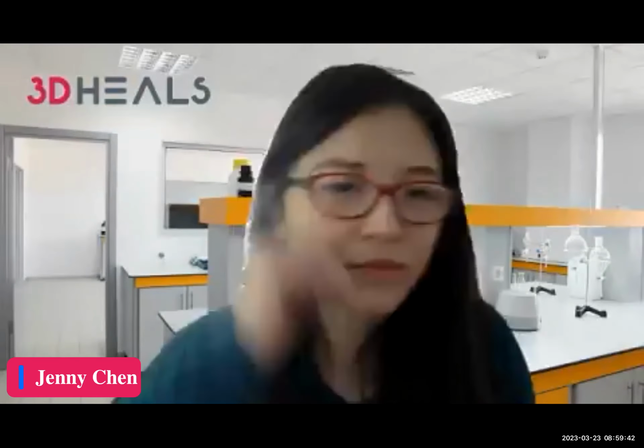Sure. So I mostly use the Structure scanner, which is an iPad-based scanner. And then we also take circumference measurements a lot of times just to verify the dimensions and make sure there aren't distortions. With the iPhone, it's using the front-facing camera, and the app that I like best for that is called EM3D. It's a free app, and then it's a one-time, I think, $7 fee to export STL files. So those are the main two.